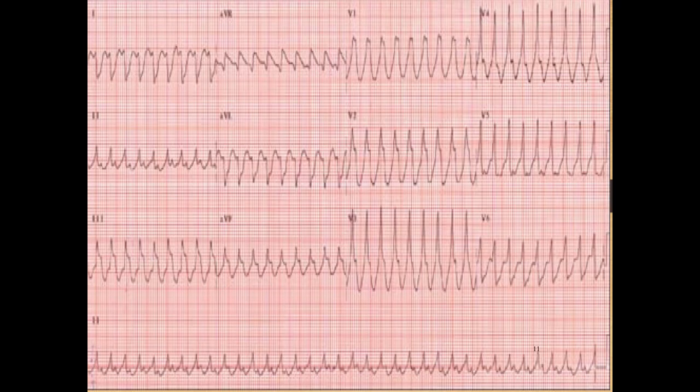Do we have Josephson's sign, which is separate from Brugada's criteria, but we're still going to talk about it. On the negative slopes of our QRS complexes, do we have a little notch? And we don't. Okay, so we're still thinking away from V-Tach. All these are rule-ins for V-Tach. They want us to catch V-Tach as early as possible, because that's the bad one. That's the worst one. So I'm being steered away from V-Tach right now.